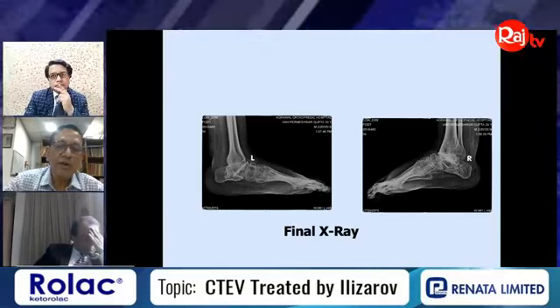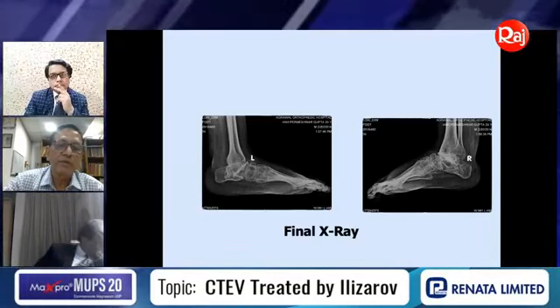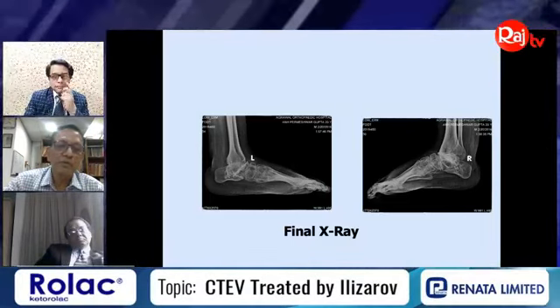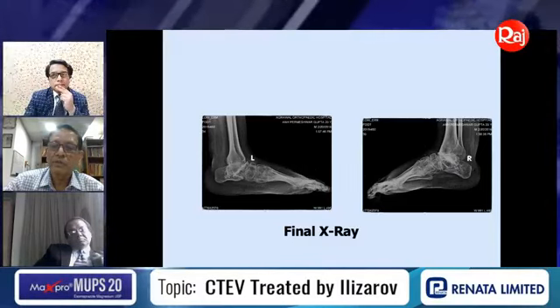But usually what I do is put a wedge there. Before removing the wedge, the only issue is that the foot becomes short. But I personally found that we do the osteotomy percutaneously, and we remove a wedge from both sides here. You can see there.